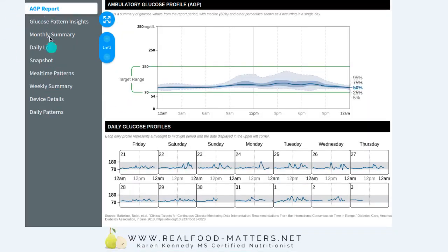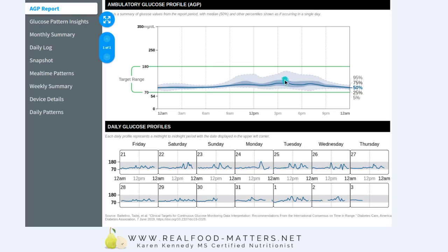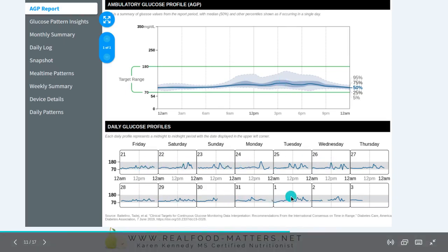Here's another view — on this list over here you can go to the AGP report. The AGP report is somewhat useful in that it gives you a chance to see trends. This is like a summary of an entire week and it tells you the trends of this particular person. One great thing you can see here is their overnight trend is really flat — that's a great thing, because that's often the first thing I'm looking at: what is their glucose like overnight? Are they able to be in a fasted state for 12 hours overnight? If it's bouncing around for whatever reason, you've got some dysglycemia or interrupted sleep, and that's where this becomes a great way to diagnose things.